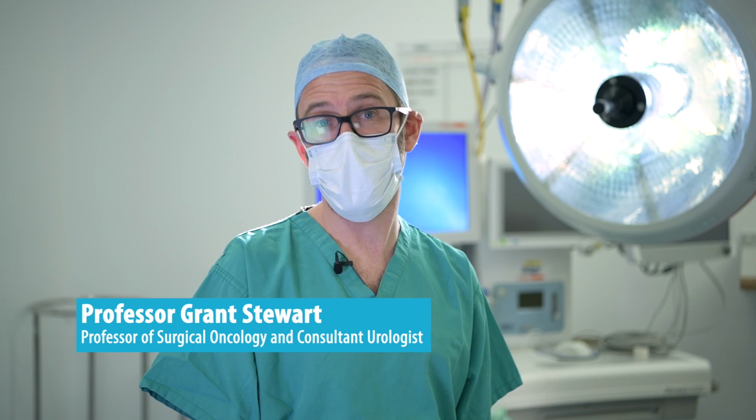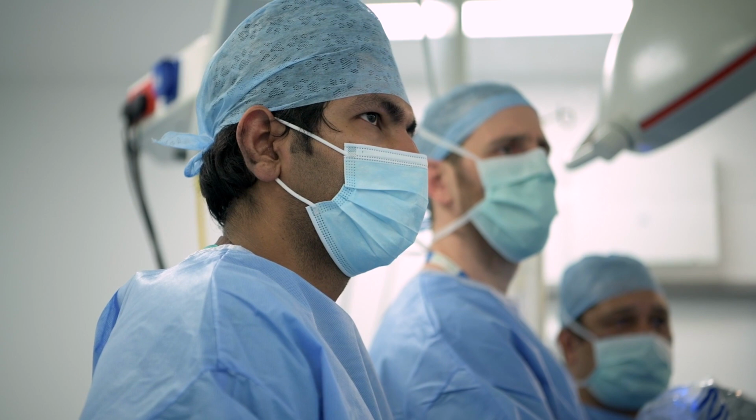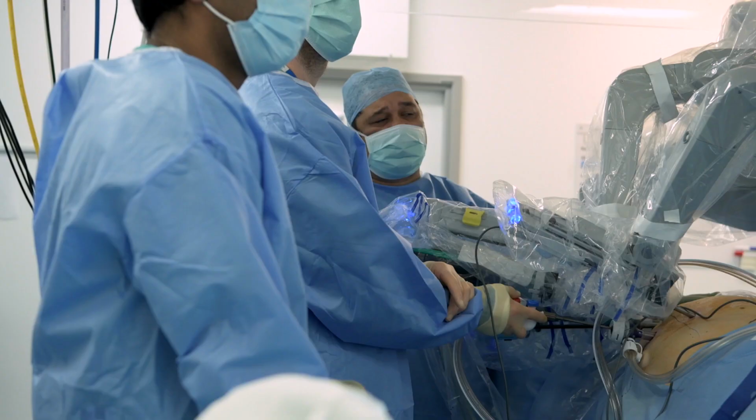Urological cancers like kidney, bladder and prostate cancer, colorectal cancer patients, patients with cancers of the gynecological organs, patients who have liver or pancreatic cancers, and those with cancers of the head and neck area would all benefit from being offered robotic surgery. It gives you better access and it can get into the nooks and crannies that surgeons cannot usually get into without making big incisions.